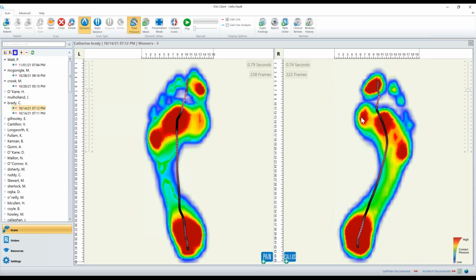Now, we had a lecturer who used to say if you had a three-legged stool and all your legs were quite far apart, so you had one here and one here, you'd be okay. You could sit in that stool and not topple. Whereas if you have a stool like this where you've got one leg here and one leg here, you have to balance on it rather than it allowing you to sit on it. So there's no stability. The flatter and straighter the gait line, the less stability.